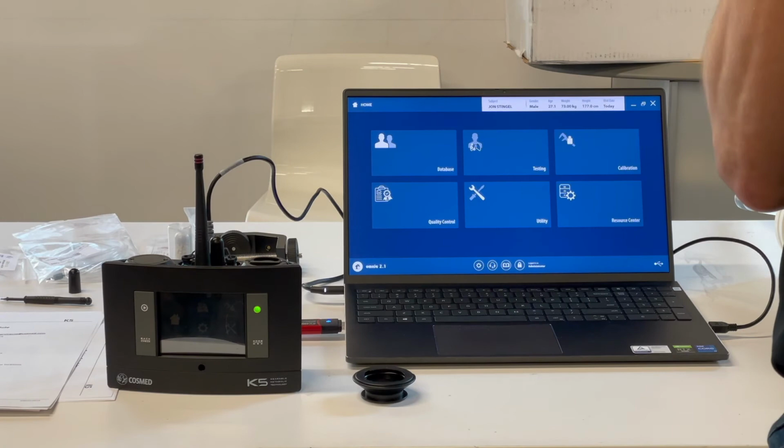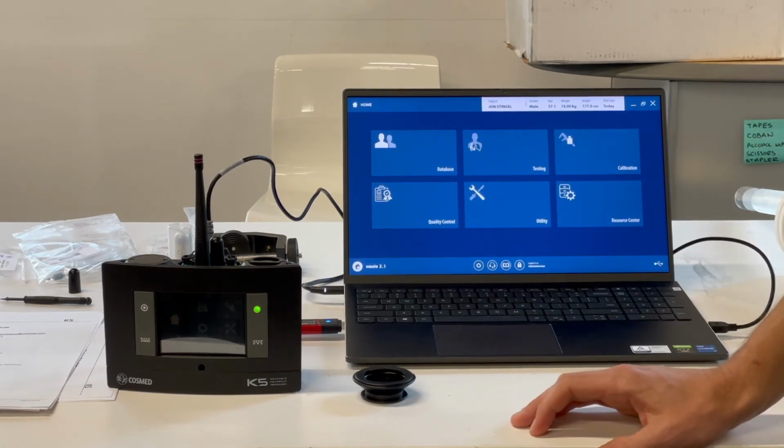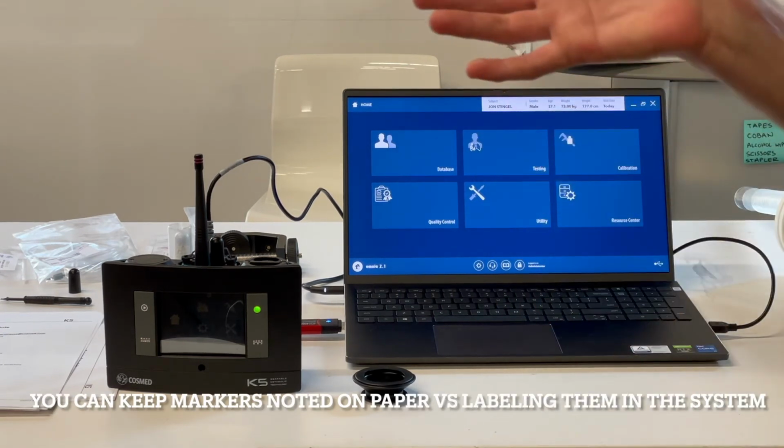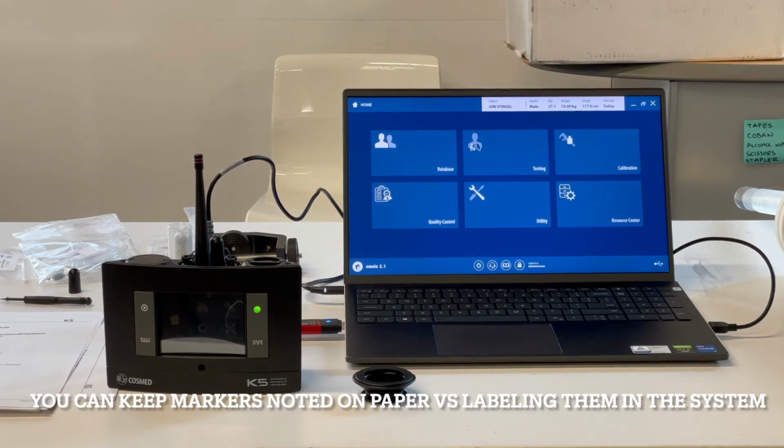Well, we just keep measuring, and as each aspect of the protocol changes, whether it's the standing or the treadmill or the walking, they're recorded while they're resting in between the running and the walking. We just keep going and add all these markers. I personally wouldn't do it that way. I just don't like the data to have all the markers in it, because if you're looking at the raw file, it's going to drop all these markers on there.